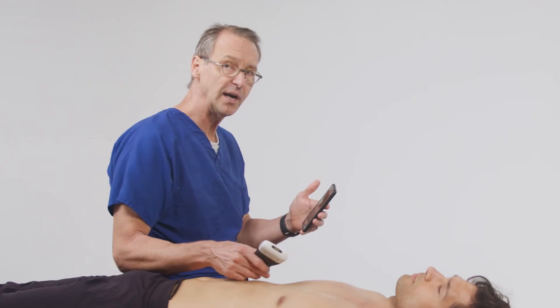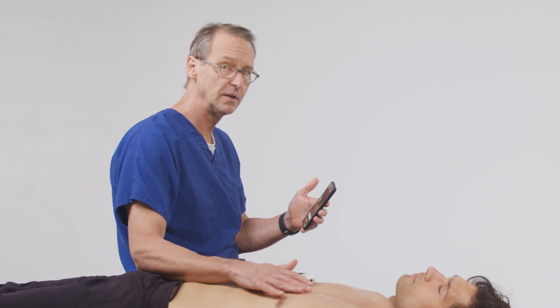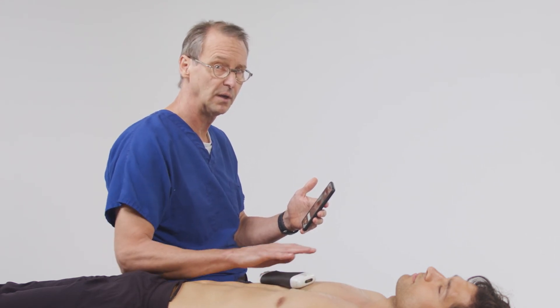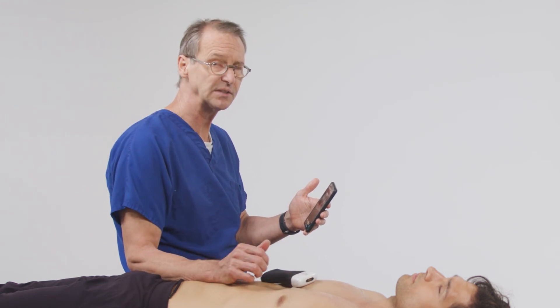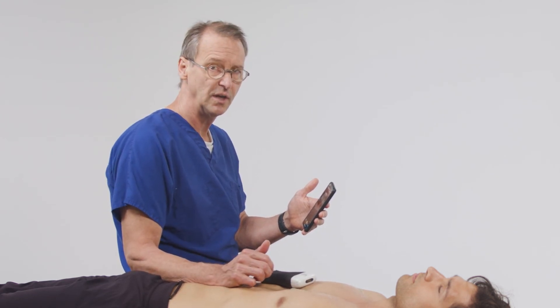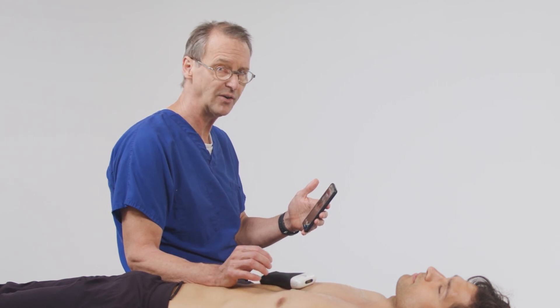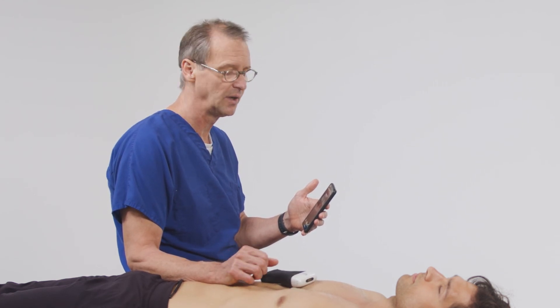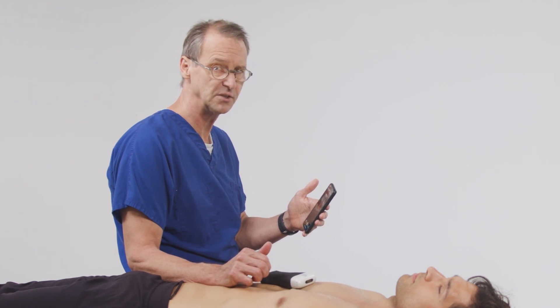To summarize the RUSH exam, we look at the heart, the inferior vena cava, the right upper quadrant, and both lung fields. We can accomplish this examination within three to four minutes. It gives us very important information about not only the type of shock we're dealing with, but also what our next management decision should be.